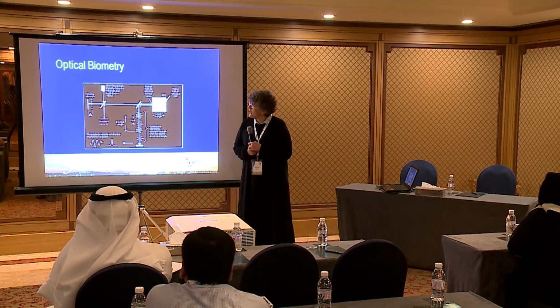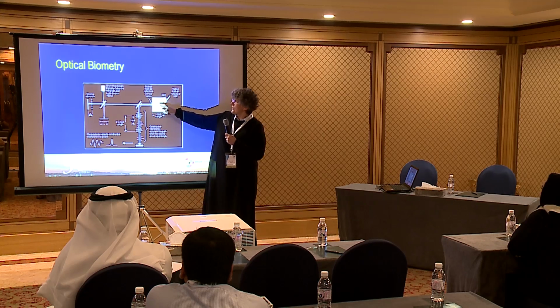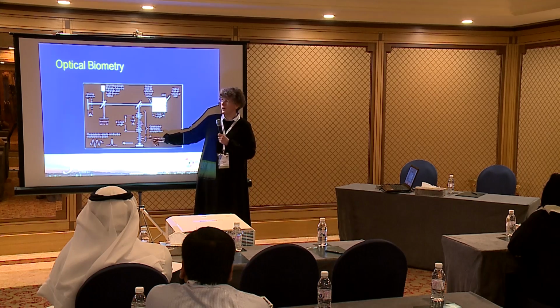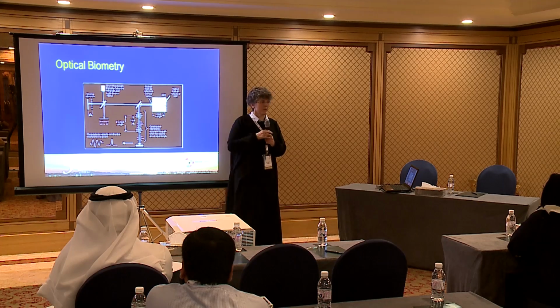This is where I want to remind myself how it works. So we see the light going in, there is an interference being caused, and this is caught on the mirrors, and then the difference in the wavelength will give you the length of the eye.